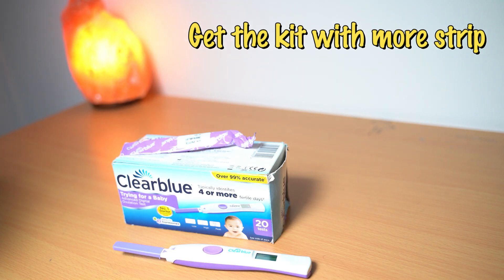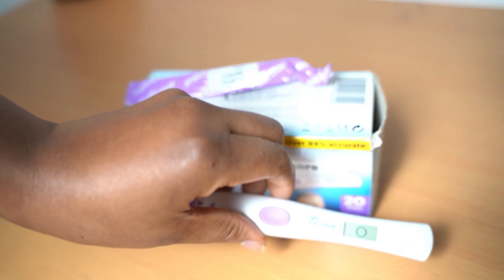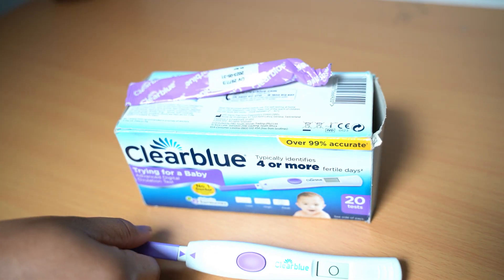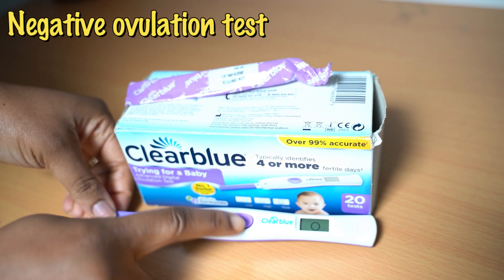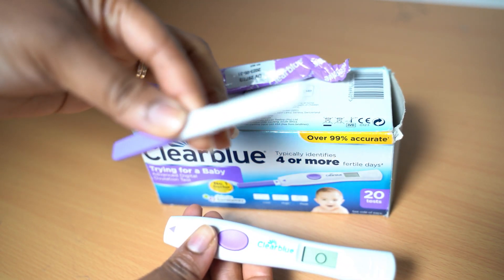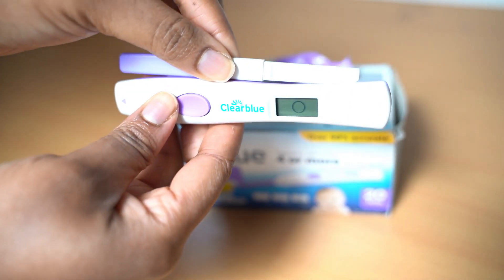We'll continue waiting for it to read the results. Clearblue ovulation kit is the best kit that you can ever have. Oh — circle means no ovulation! There's no ovulation. So what you need to do is press there — press there — and it comes out. This is the strip and this is the holder, and it tells you no ovulation.